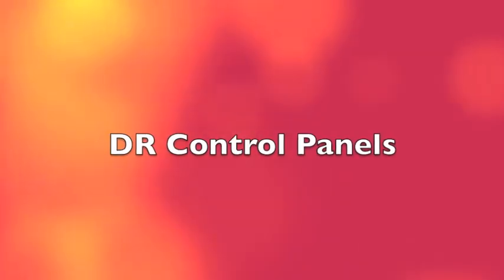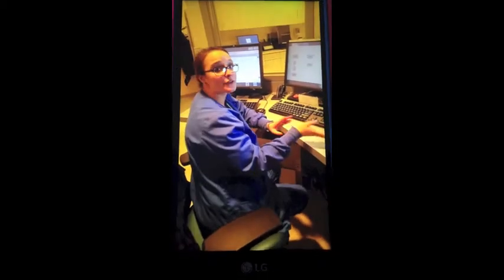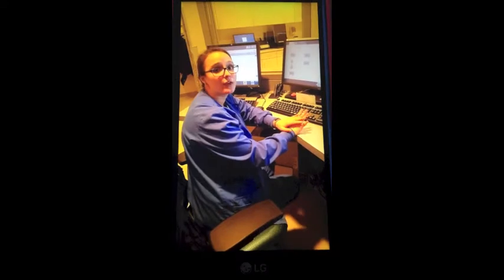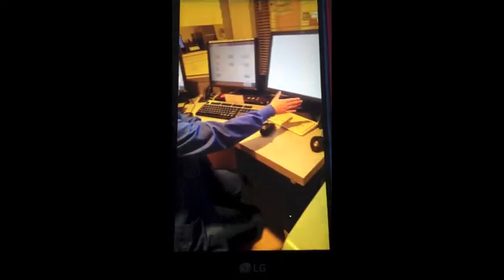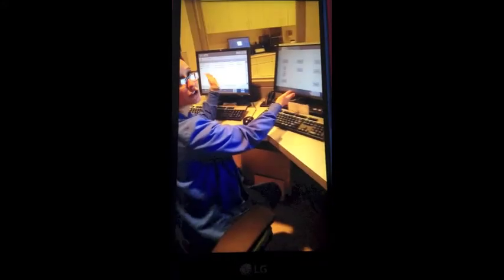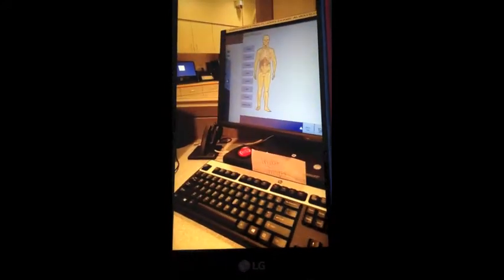All right. I'm going to show y'all how to start an exam if you are using the digital cassette. You will not use this monitor like you would use for fluoro. You're only going to focus on these two screens. For this one, you're going to choose the button that says Start Cassette Only, and that will be for your digital cassette.